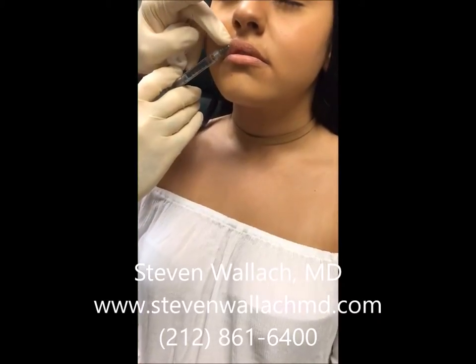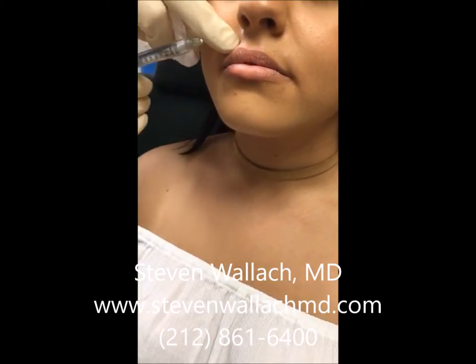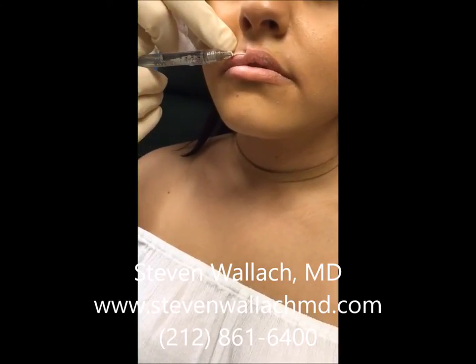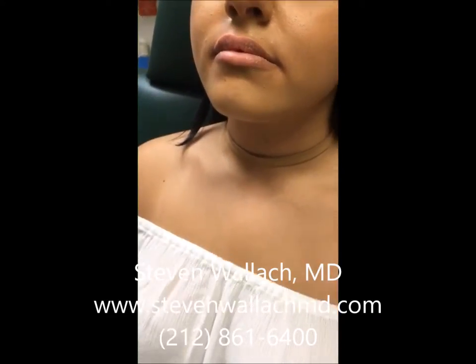This specific patient requested that her lip line be augmented a little bit. This is usually my preference to start with. I like to inject serially along the lip line as I'm doing here, starting on the right side and then working my way along the cupid's bow.